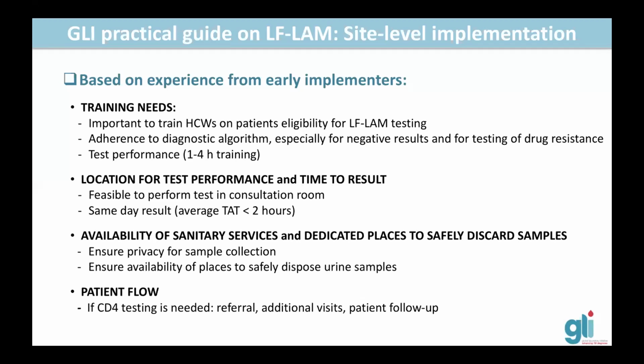And then, importantly, the early experience has shown that it's feasible to perform this test in consultation rooms. So really, it's a bedside test. And then, when it comes to facility level implementation, it's important also to ensure privacy for sample collection and availability of places to safely dispose of the urine samples.